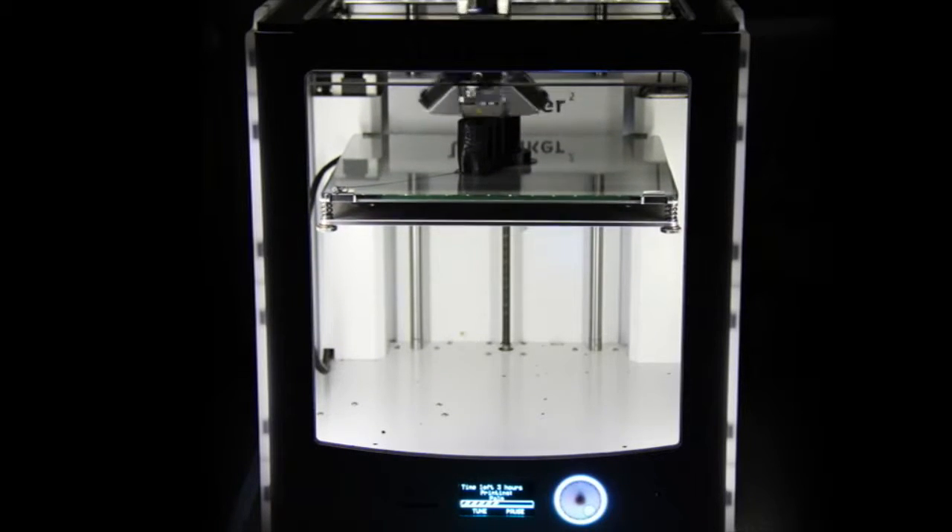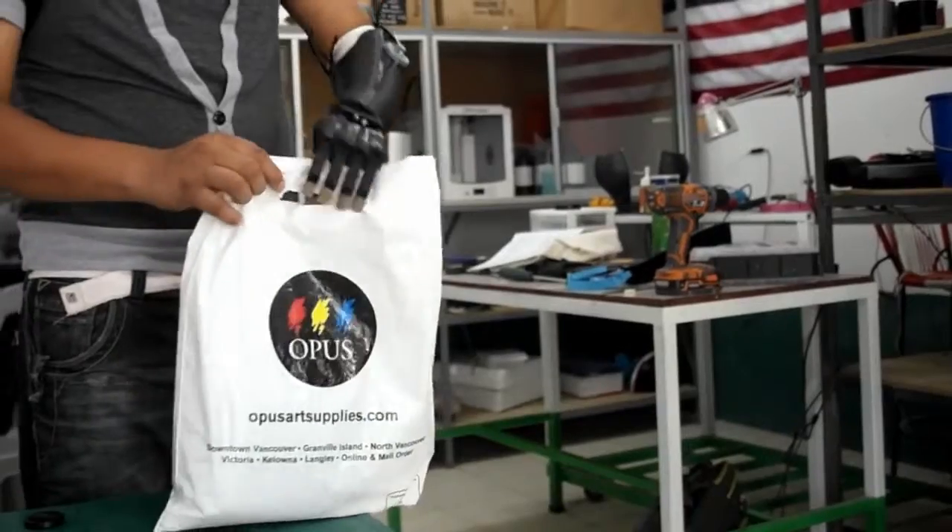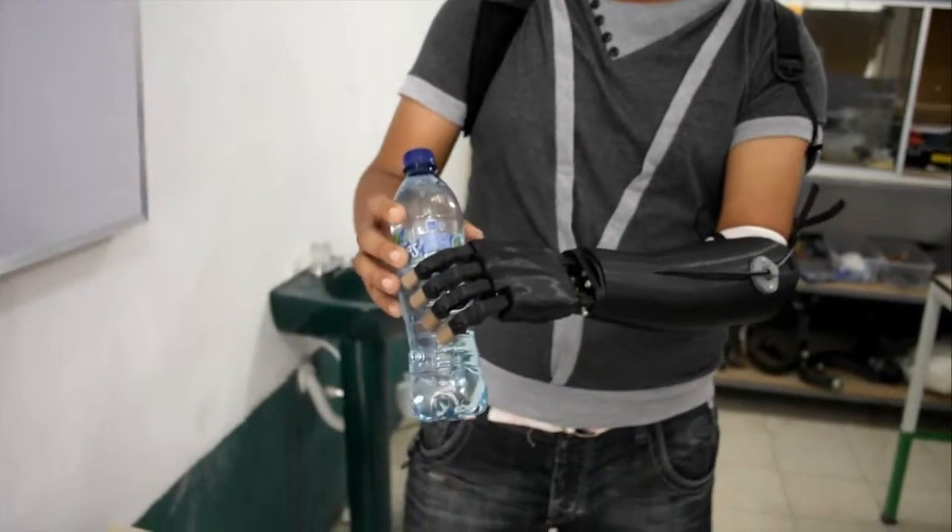By using 3D printing, we were able to create a low-cost prosthetic that has many features commonly found in advanced prosthetics on the market today.